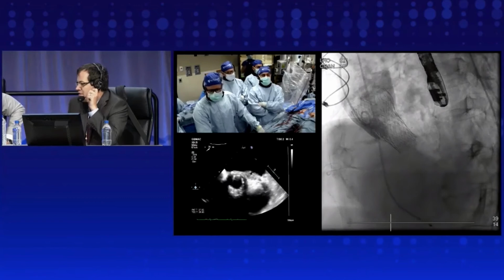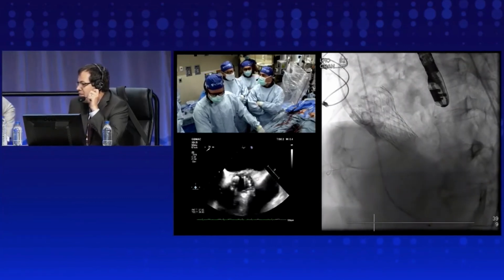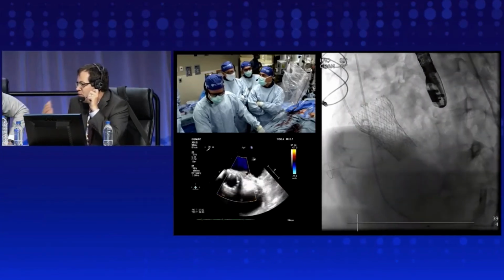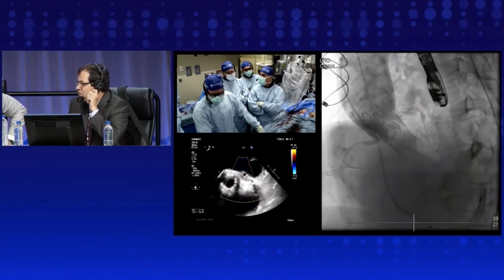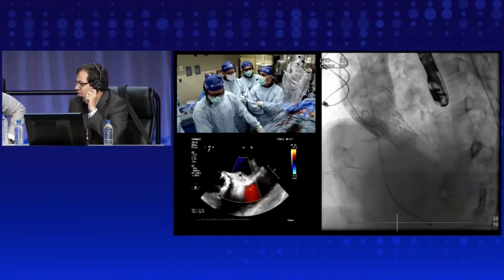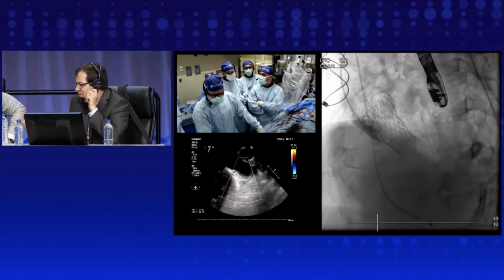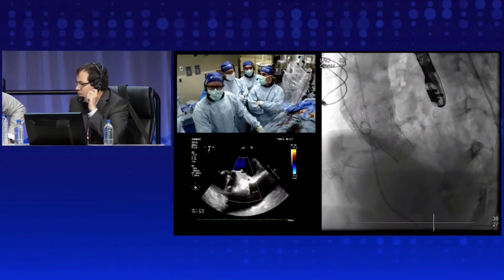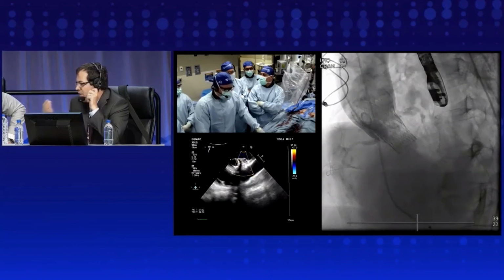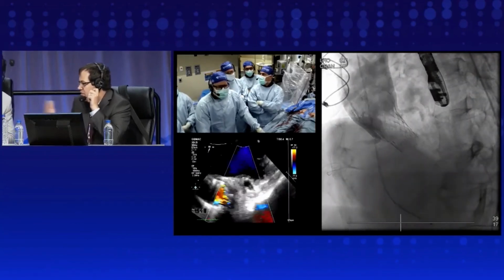And the predictors, there are cases like this where it's an almost definite occlusion, but the majority of the cases may meet the certain CT predictors that have been defined. Even when you meet the predictors, the majority of cases don't actually occlude, and you are able to remove rather than deploy the stents. So there is a difference between doing a prophylactic versus a responsive procedure, and you may end up doing more procedures this way. So I would ask how you select: is it any patient that meets a CT criteria, you automatically do a Basilica, or are there gradations?